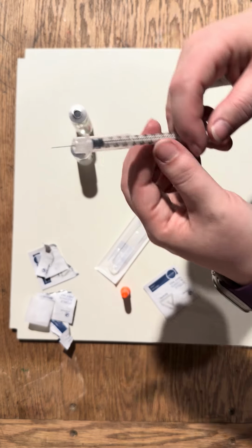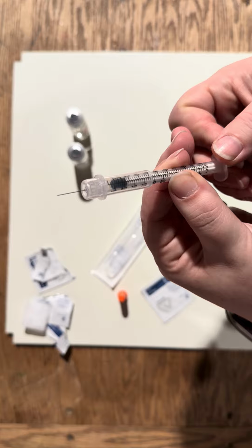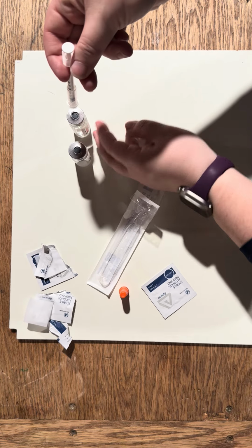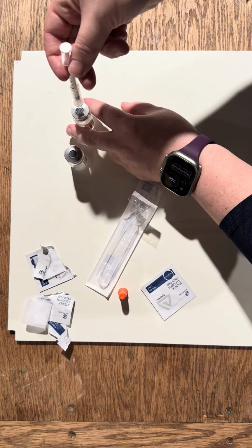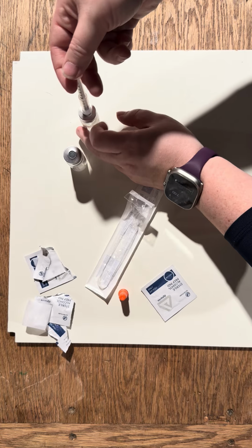And then I will draw back, and then I will pull up to 6 of air. And I will then inject that into the regular, into the airspace, but I will not be withdrawing.